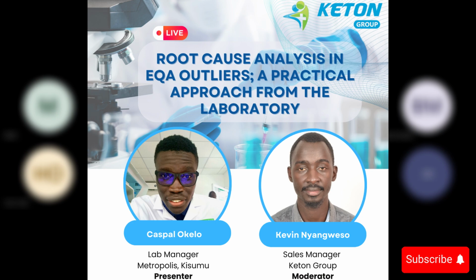So it simply indicates whether a result deviates significantly from the expected standard. The Z-score, on the other hand, is a general statistical measure. It tells you the relative position of the data point within the data set, showing how many standard deviations your value is above or below the mean.